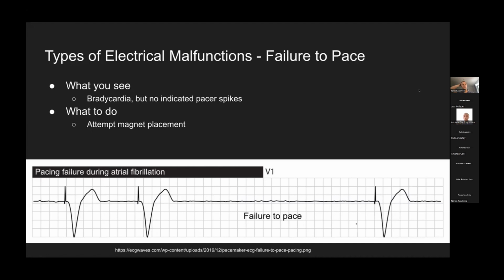One of the things that I thought was really interesting, when I was a paramedic, we could do transcutaneous pacing on the ambulance, which I only ran into once. But I expected it to be this crazy aggressive thing, just like a defibrillation, but repeatedly. And sometimes it's actually fairly well tolerated. Sometimes they do need a little bit of sedation, or maybe a lot of sedation, depending.